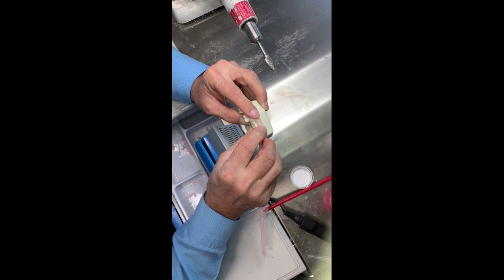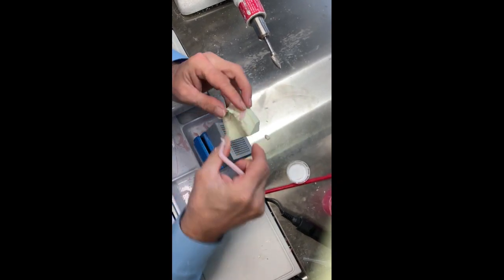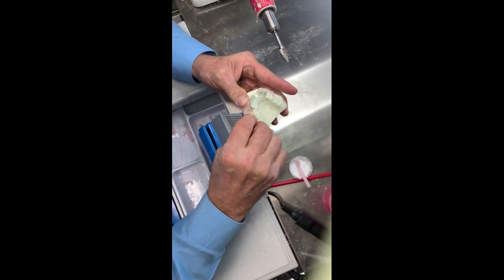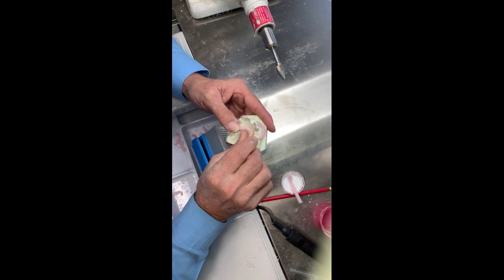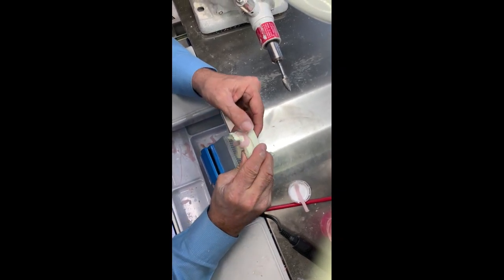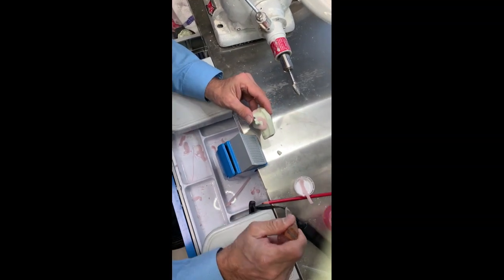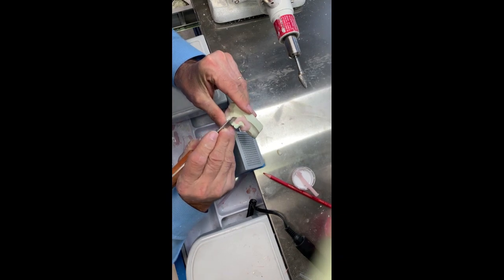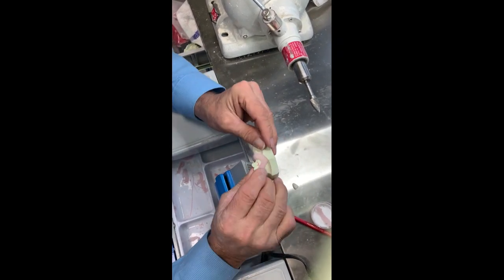We'll place the wax around the line, to make it easier for the acrylic. Once you place the wax here, you can go ahead and form it roughly to the line. And this wax is pretty sticky, so you don't have to heat it up. Makes it easy to work with. So you want to do it about like this.